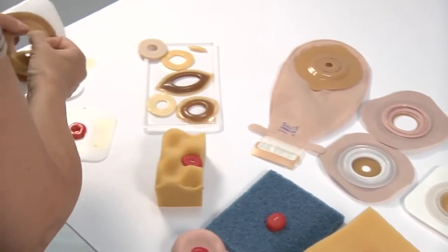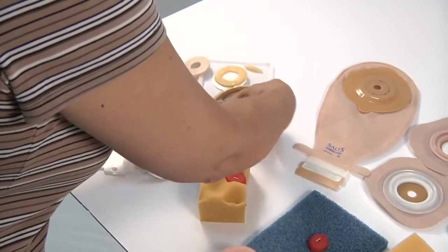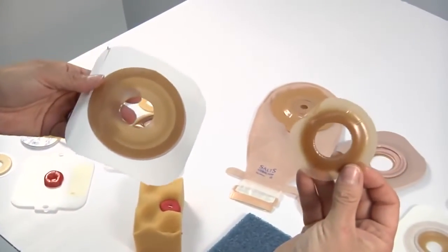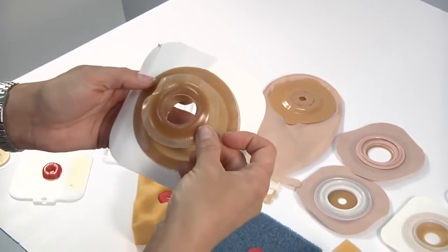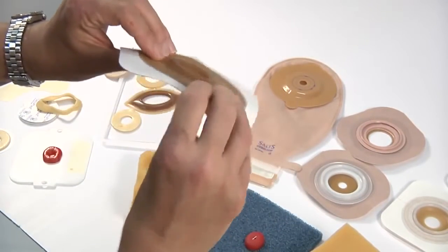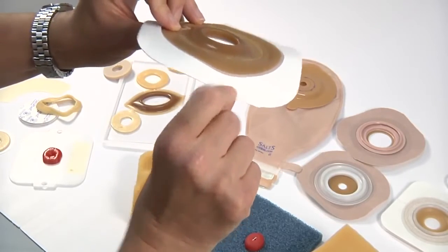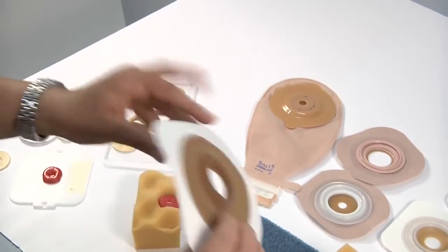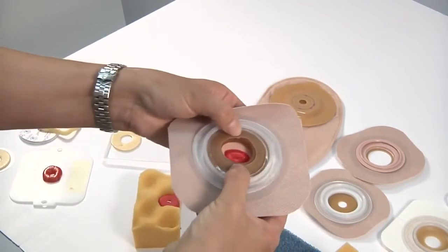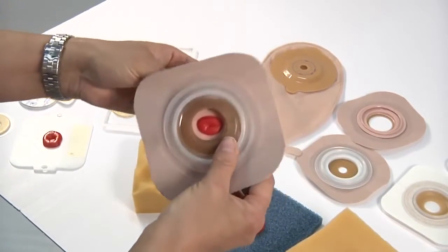Equally, you could take a convex barrier ring, like this one here from Hollister, and you could put that again on the back of the flange. And again, you can see that you've actually made a relatively low level of convexity. You've definitely got some degree of protrusion. And again, you could now take that and see, am I happy with how that's starting to fill in the gaps and creases around that particular stoma?